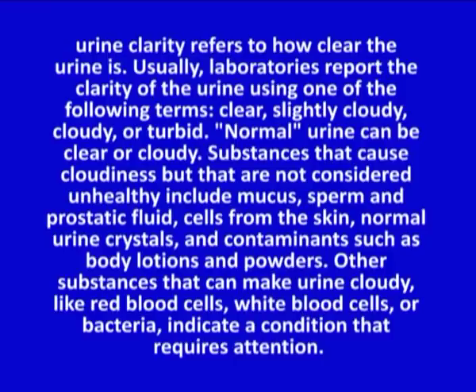Other substances that can make urine cloudy, like red blood cells, white blood cells, or bacteria, indicate a condition that requires attention.